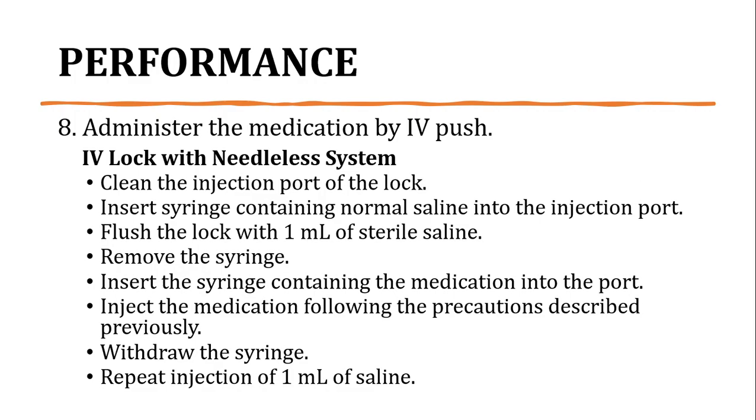Then insert syringe containing normal saline into the injection port for flushing of the IV lock. Flush the lock with 1 ml of sterile saline. Remove the syringe. Then insert the syringe containing the medication into the port.